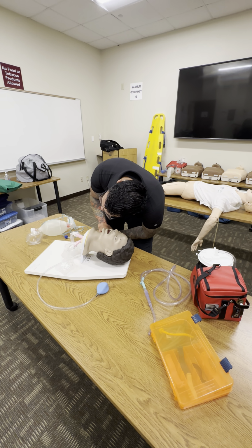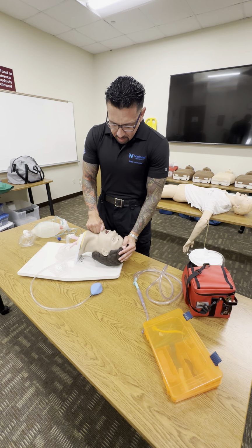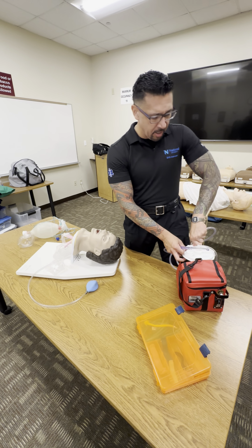The patient is unresponsive, apneic, and has a weak pulse of 60. I'm gonna open the airway, head tilt, chin lift. What do I see? The mouth is full of secretions and vomitus. This suction should have already been attached.